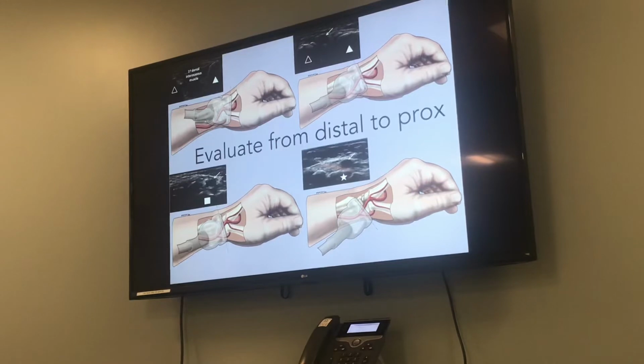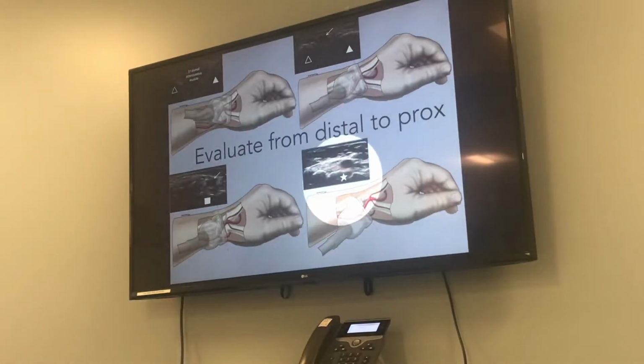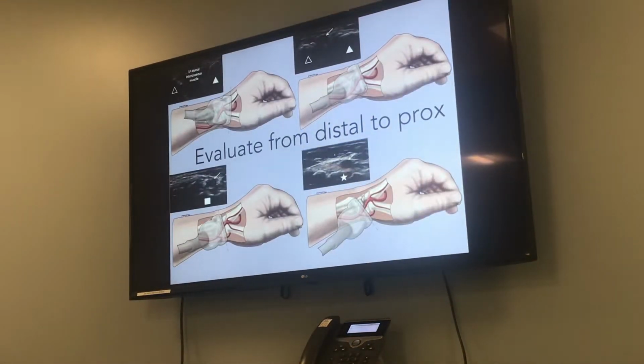And we're doing that because if you look on the ultrasound, I'll just point this out to you. If you look there, directly under the artery is a bone. And so that's what's so easy to get hemostasis. And also, you can see here, this is the local anesthetic that we've injected, this black stuff here. You can see how easily it looks like there's a hematoma there. It's not, it's just local anesthetic.